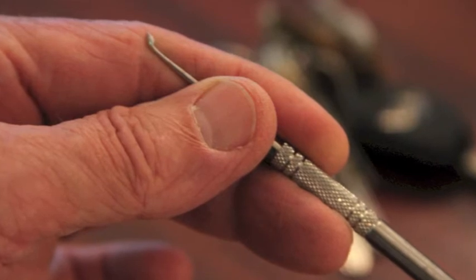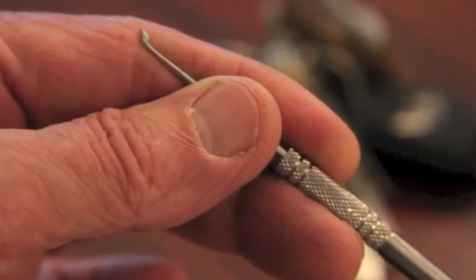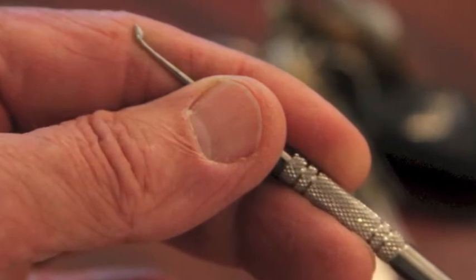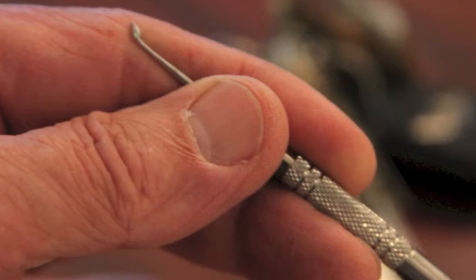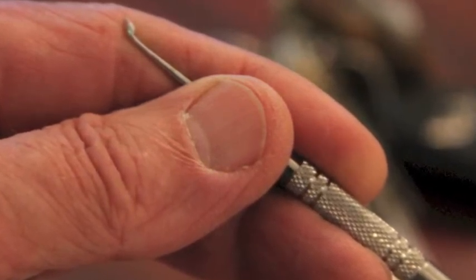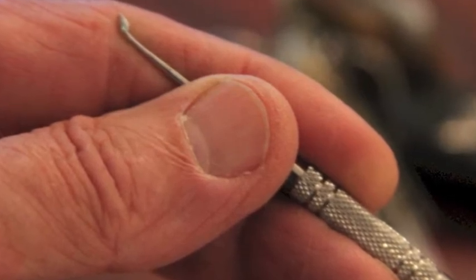In this next segment, my assistant and I are going to be doing a simulated restorative procedure, a composite restoration. We will be highlighting each of the steps, but as you watch, notice the transfer, because as you work as a dental assistant, you too will be providing this kind of assistance for your doctor.